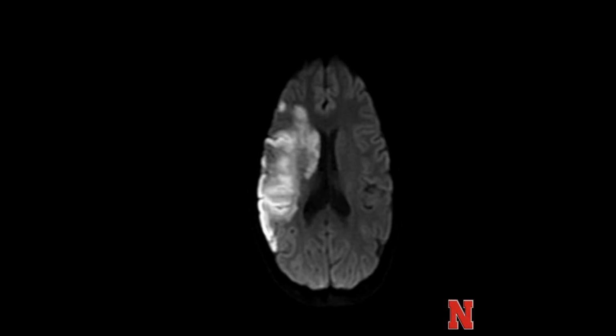So here's an example. The classic example of diffusion-weighted imaging is used in brain MRI for stroke evaluation. In the territory of a stroke, this is a right MCA infarct, the cells become relatively restricted in their movement. They cause restricted diffusion, and this is the go-to sequence for looking for acute stroke.